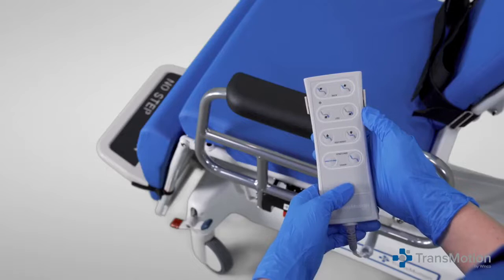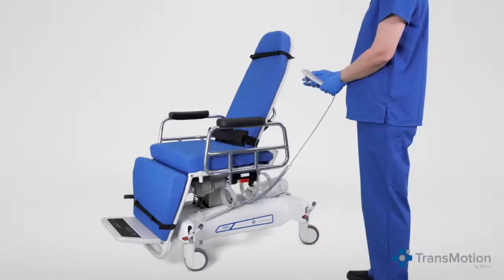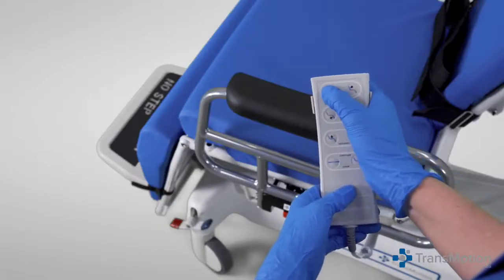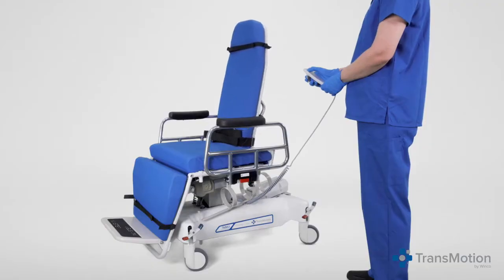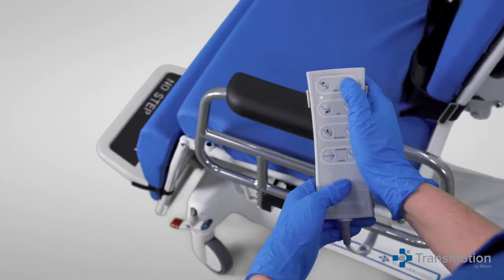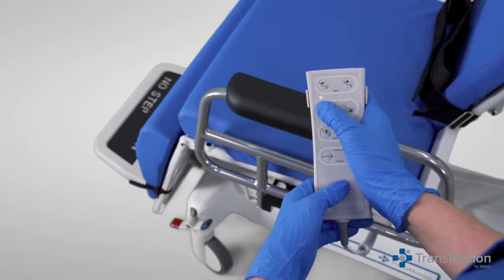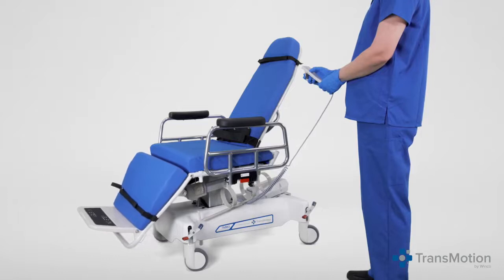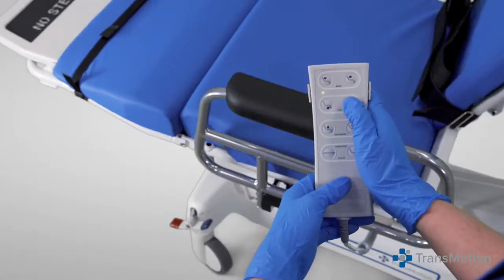The multiple chair positions are controlled at the press of a button, and each position can be separately controlled. The first row buttons on the pendant control the back section recline level — press the left button to raise the chair back, or the right button to lower the back as indicated by the arrows. The second row buttons control the leg section incline level — press the left button to raise the chair leg, or the right to lower the leg section as indicated by the arrows.